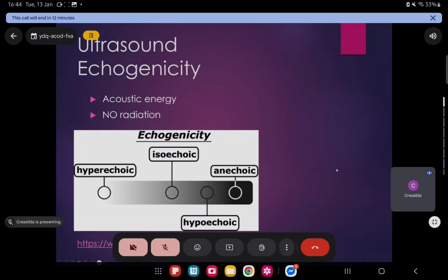So when we talk about ultrasound, we talk about echogenicity. So this reflects more of the echoes. Hypoechoic would appear darker than the surrounding. Anechoic means that it transmits all echoes, so it's completely black. So this is a study of choice for the female pelvis, gravid patients, pediatric patients. It can differentiate solid versus cystic, and it is also a non-invasive vascular imaging.